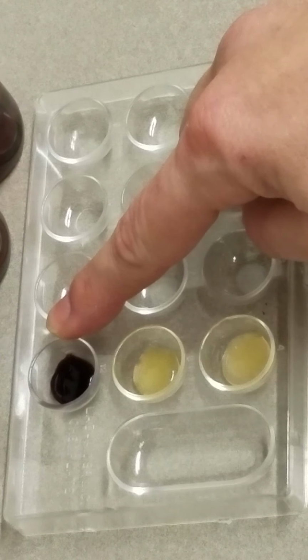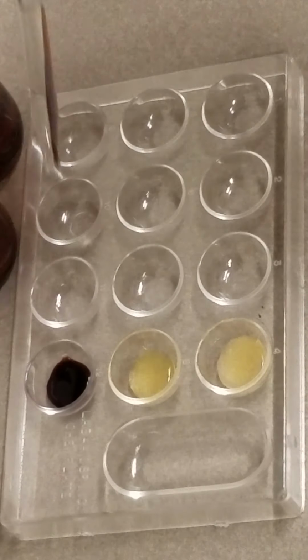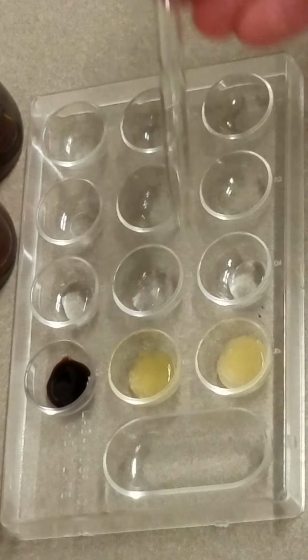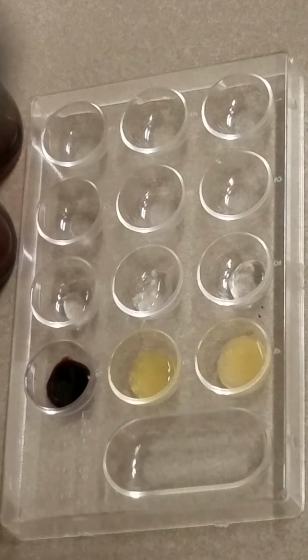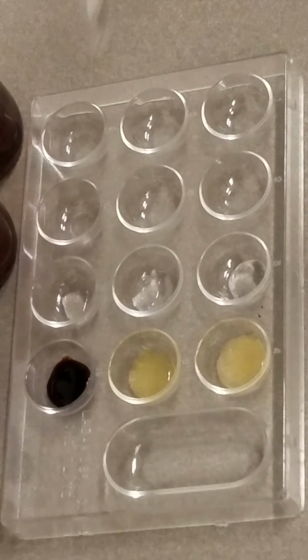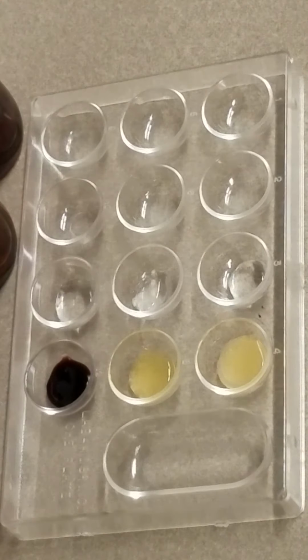So now I have B negative, and I'll add B negative in the same way that I did my first sample of A positive. Now the anti-A. I don't get a reaction, which I expect. I know that I have B blood, so I shouldn't get a reaction when I add the anti-A.